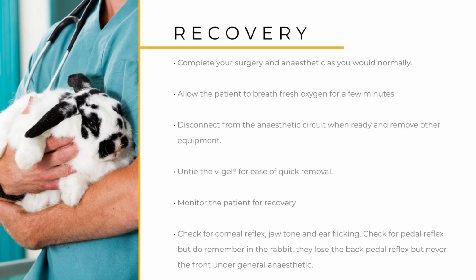Recovery. Complete your surgery and anaesthetic as you would normally. Allow the patient to breathe fresh oxygen for several minutes and disconnect from the circuit when you are ready. Remove all other equipment and untie the V-Gel for quick removal. Continue to monitor the patient for recovery by checking the reflexes. Don't forget, a cough reflex will not be observed.